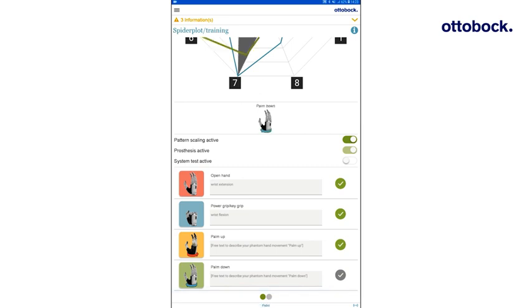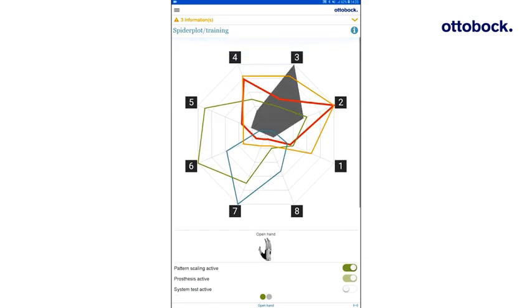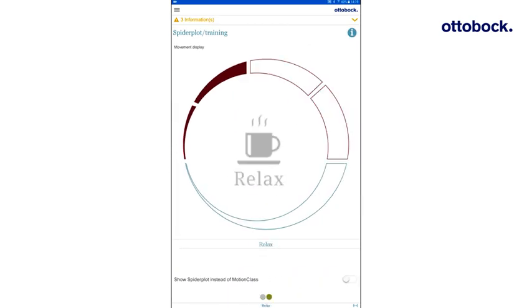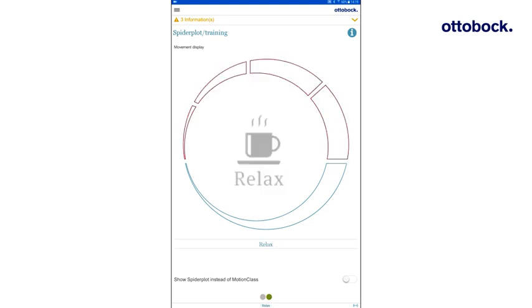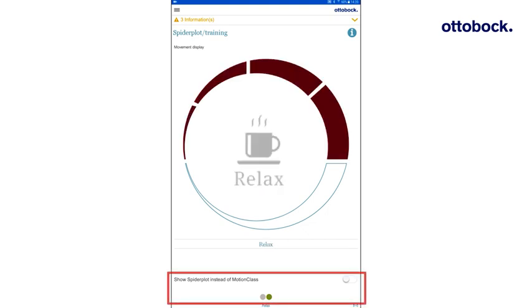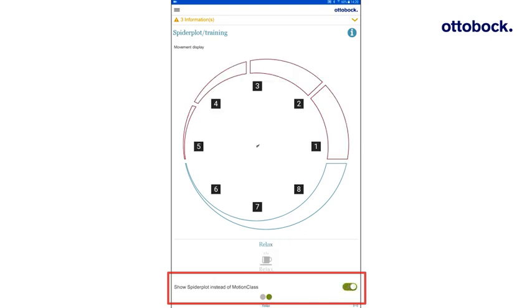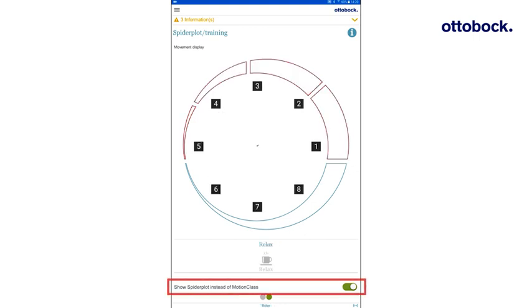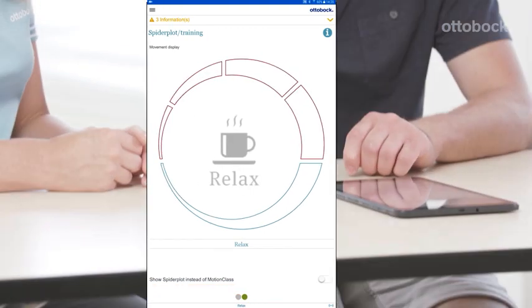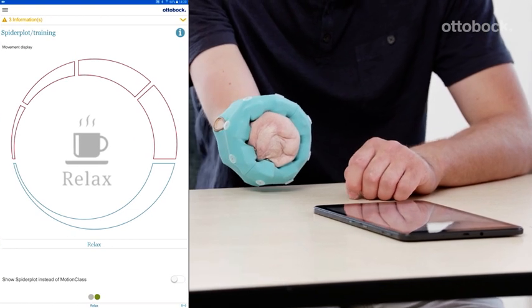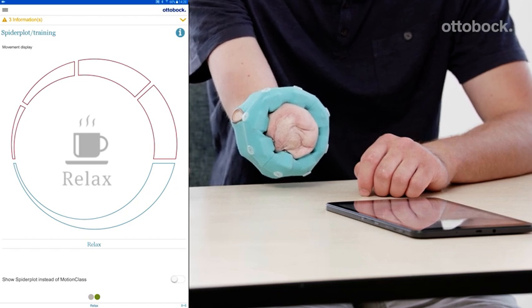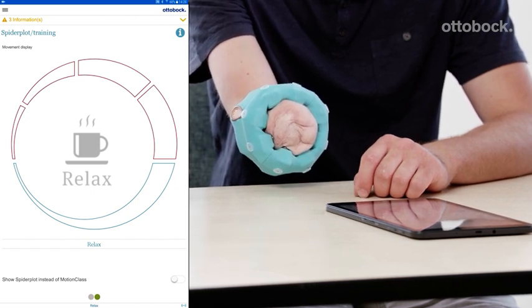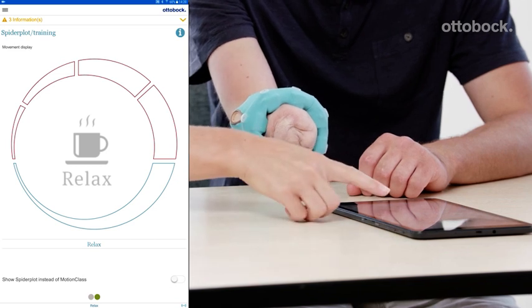The test set can also be evaluated with a movement display which is displayed by swiping left. When carrying out a phantom hand movement, the recognized prosthesis movement is shown in the middle and the red bar indicates the current contraction strength. Instead of an image of the movement, the spider plot can also be displayed. Use the movement display and the spider plot to evaluate the prosthesis control together with the user. Encourage the user to perform all recorded phantom hand movements from the test set.